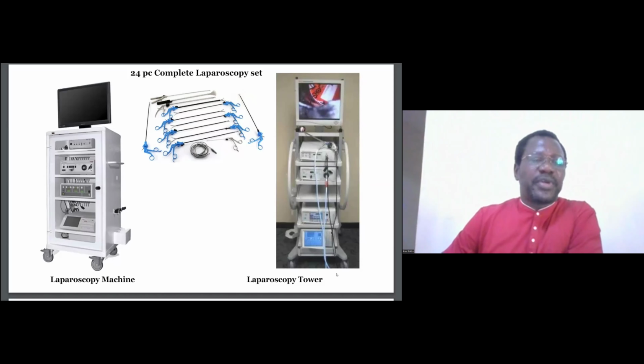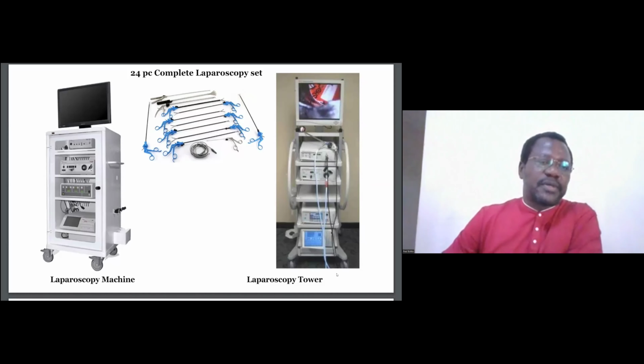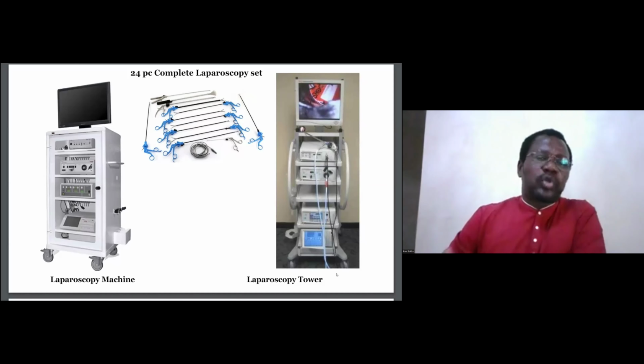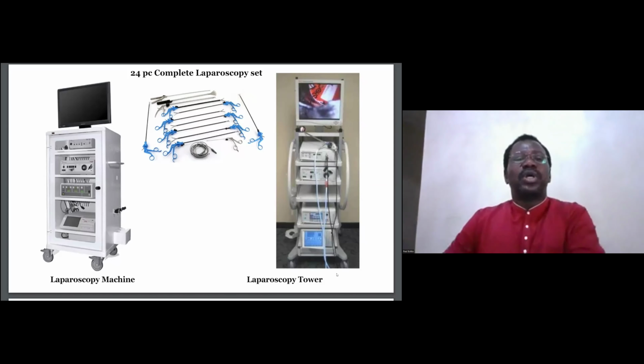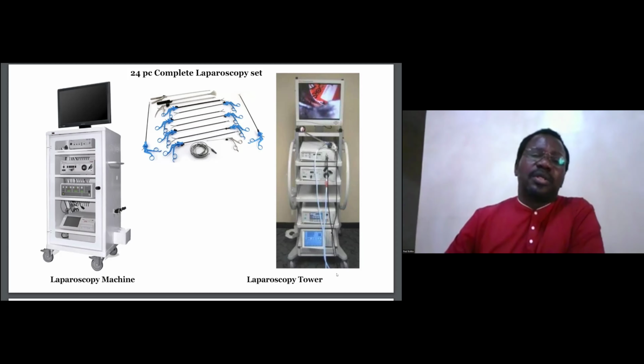Now, it has a monitor at the top of it. Then it has its gadgets. Some of them are controls, some of them are recording devices, some of them are storage devices, some of them are analytic devices. These portions in the middle are laparoscopic instruments. So they're different from the standard surgical instruments, but you can have laparoscopic scissors, laparoscopic sponge forceps, laparoscopic hemostat, laparoscopic hook, and so on and so forth. So you can just do surgery as if you are doing surgery with the standard surgical set. But this time around, you are doing it through a minimally invasive approach.